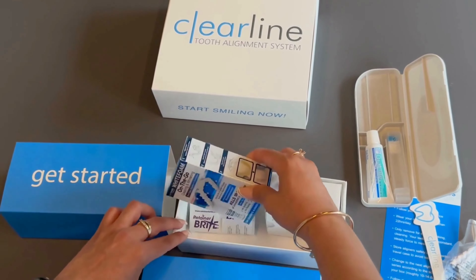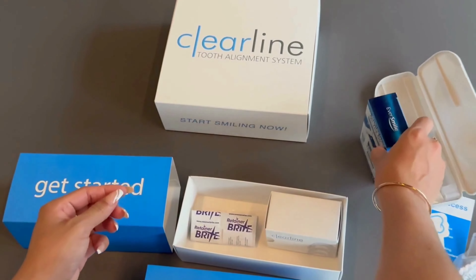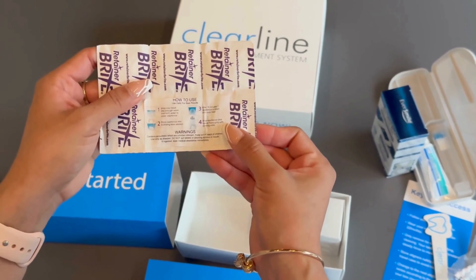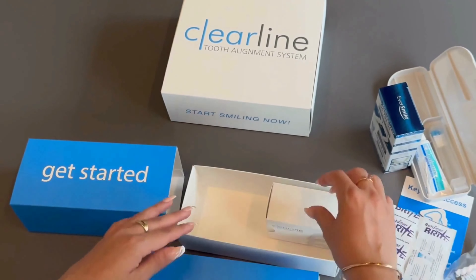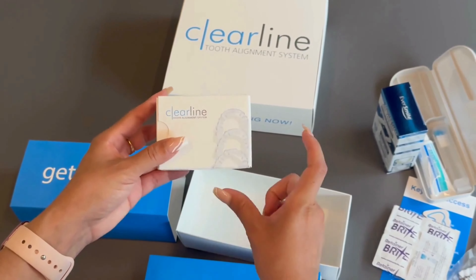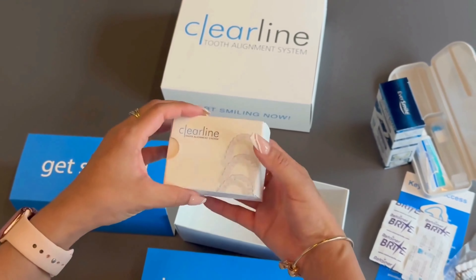The box also contains white foam for freshening and whitening your teeth, and retainer bright tablets for cleaning. Additionally, we provide the patient's first three aligners in a box, where you will also find a useful scheduling template to help plan aligner changes.